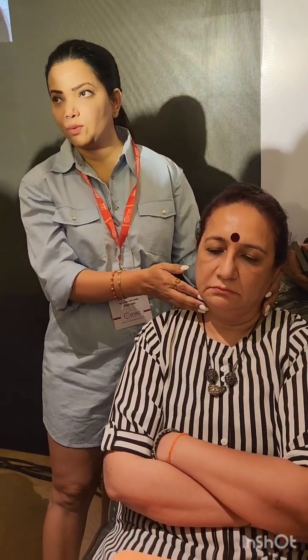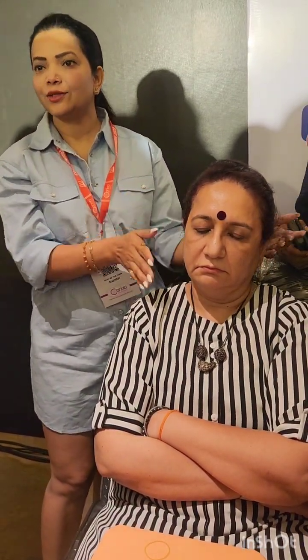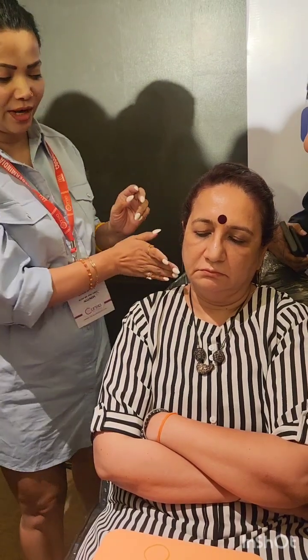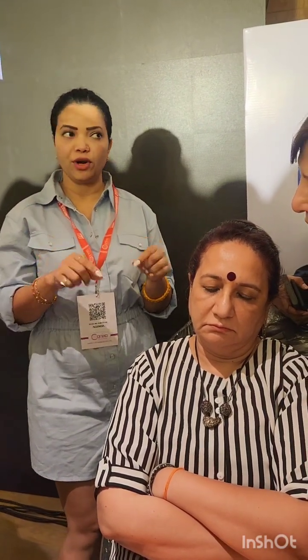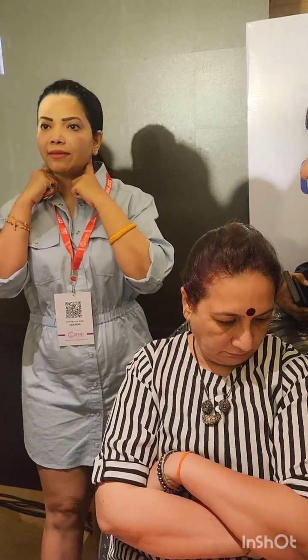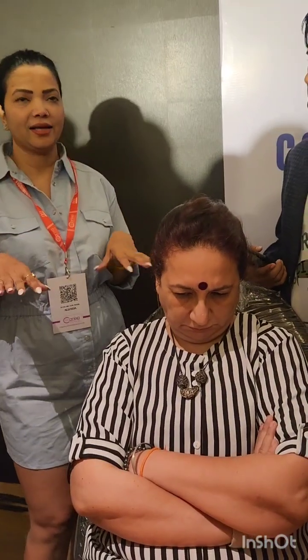Over the neck, you are using the false ligament. What is that? Platysmal auricular ligament. So the ligament is also a tough structure. So when you introduce your thread there, obviously the entry point holds everything towards it, right? And there you get the maximum fibrosis, because with the one entry point you enter many threads. Why do you enter many threads? Because we want the entry point to have the maximum fibrosis, so that it holds the tissue for a longer period of time.